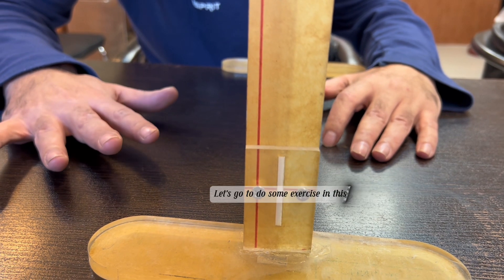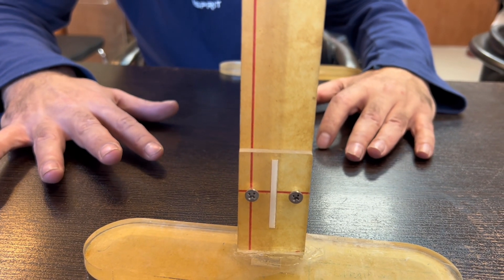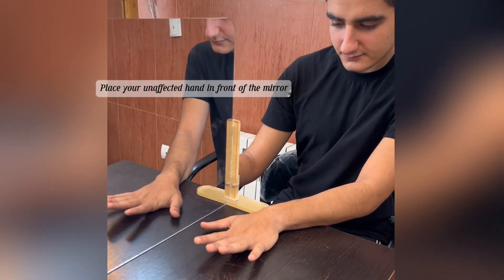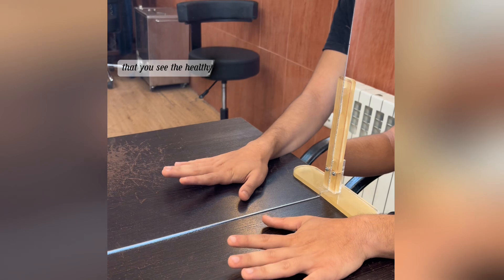Let's go do some exercises in this field. Place your unaffected hand in front of the mirror and your affected hand behind it, in such a way that you see the healthy hand in the mirror.